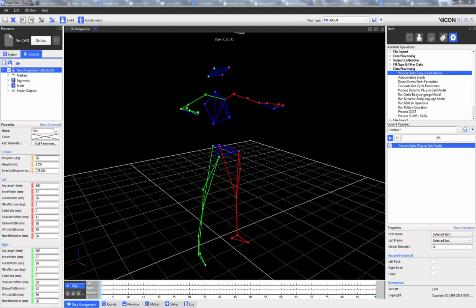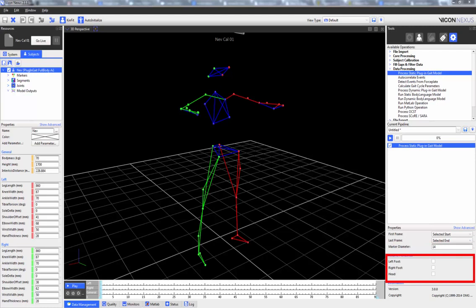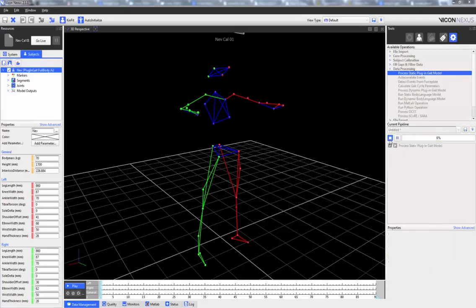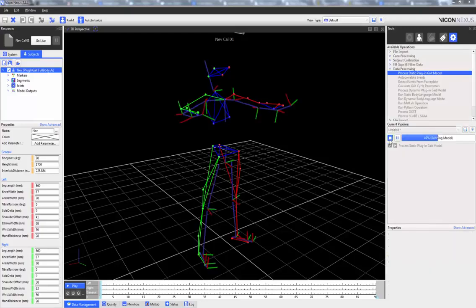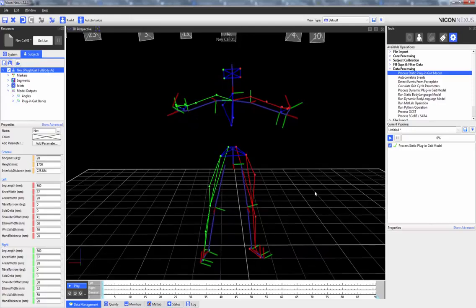The properties we can adjust are the first and last frame, the marker diameter in millimeters, and whether the left and right foot and head segments are assumed to be horizontal or not. We can see that the static plug-in gait model has been run, and we now have new model outputs such as the angles and the plug-in gait bones.